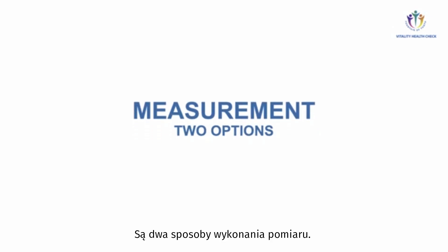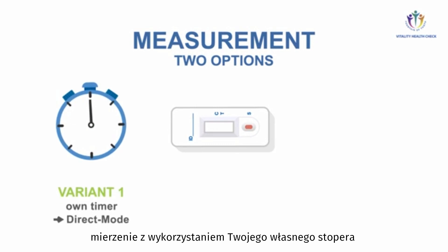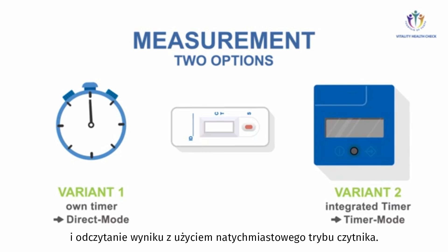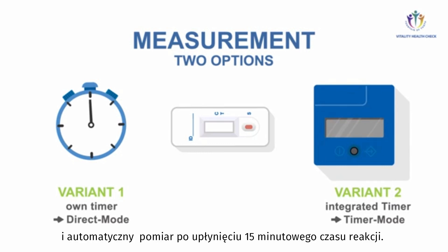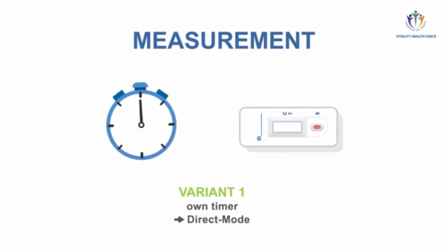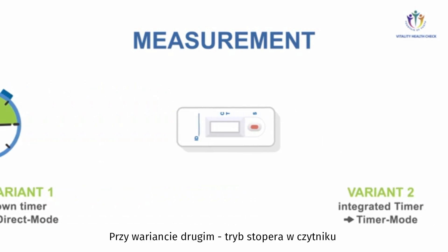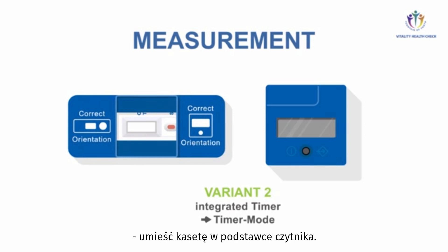There are two options to perform the measurement. Option 1: measure the reaction time with your own timer and perform readout using the direct mode of the VHC Reader. Option 2: use the timer mode of the VHC Reader with automatic measurement at the end of the 15-minute reaction time. For Variant 2, timer mode of the VHC Reader: place the adapter over the test cassette.